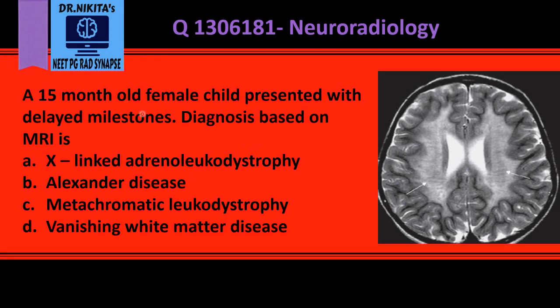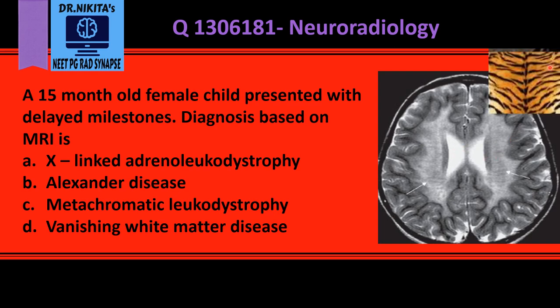A 15-month-old female child presented with delayed milestones. The diagnosis is based on MRI — this is a T2-weighted MRI where we see abnormal signal in the white matter. The pattern of abnormality shows black lines within the abnormal signal, which is similar to the Tigroid pattern, or tiger skin.